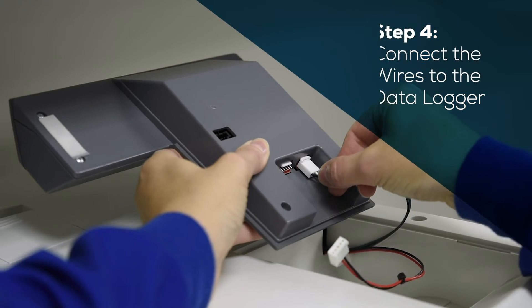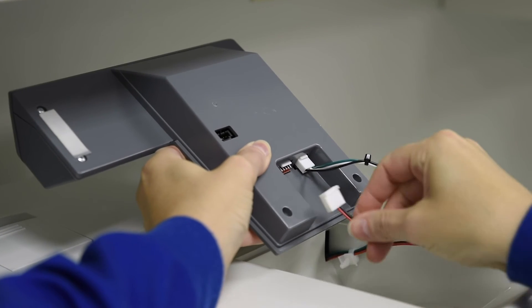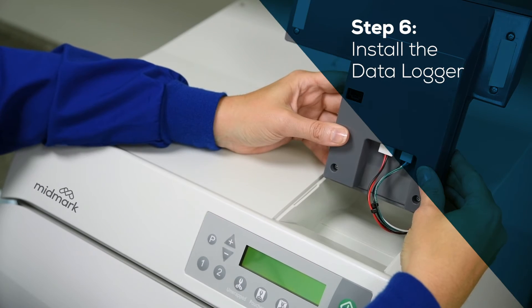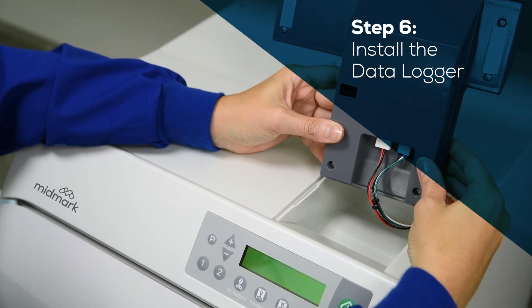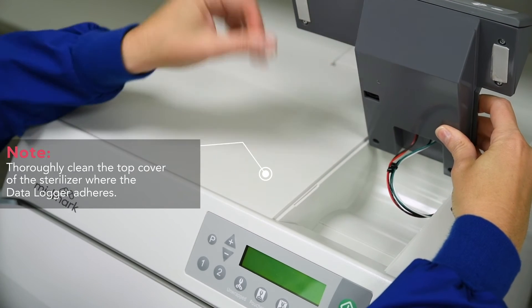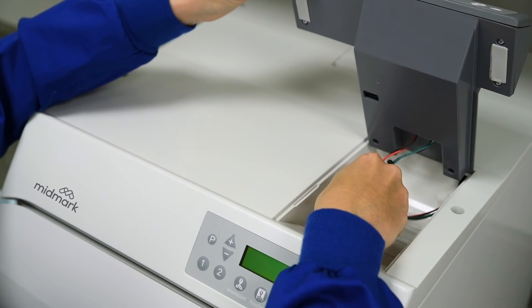Locate the wires in the sterilizer cavity and connect them to the data logger. Remove the film from the double-sided tape. Line up the back edge of the data logger into the back edge of the sterilizer cavity. Make sure the wires do not interfere with the placement of the data logger.